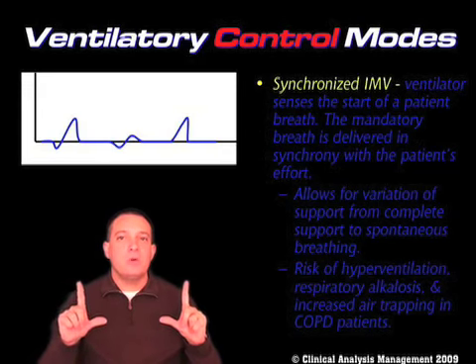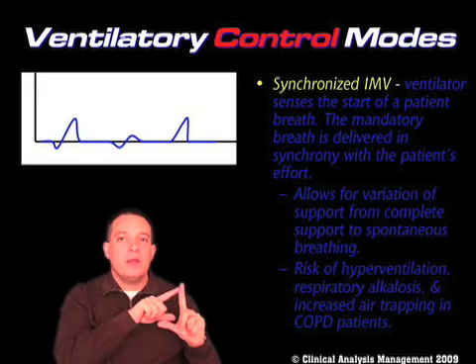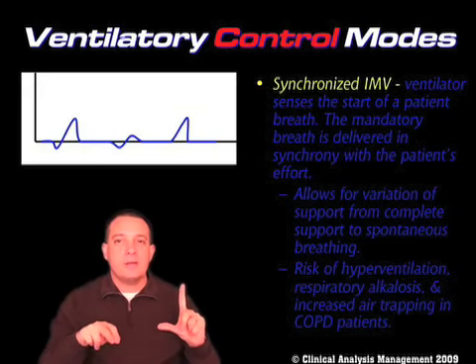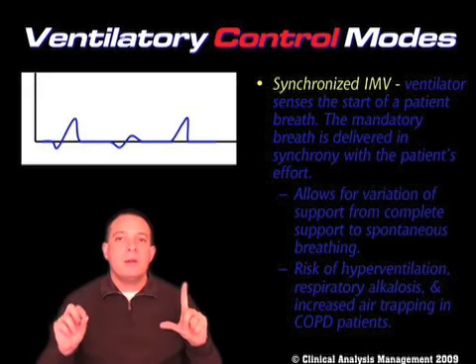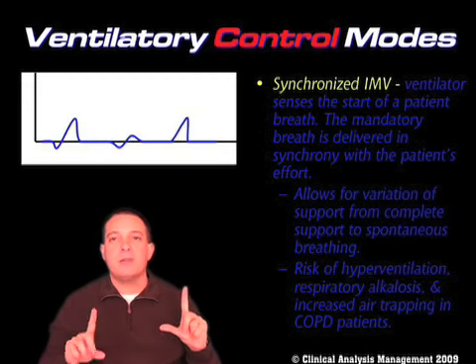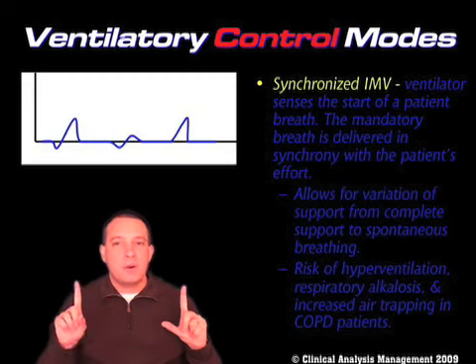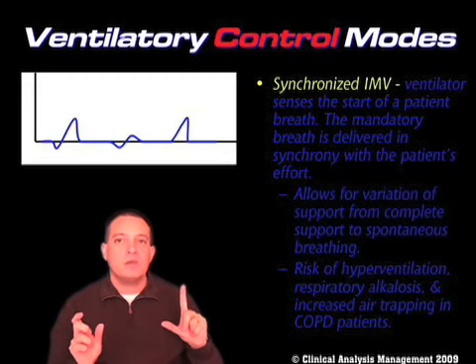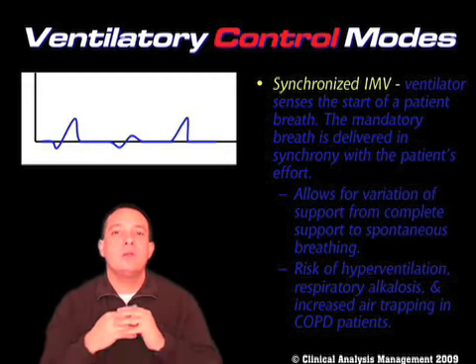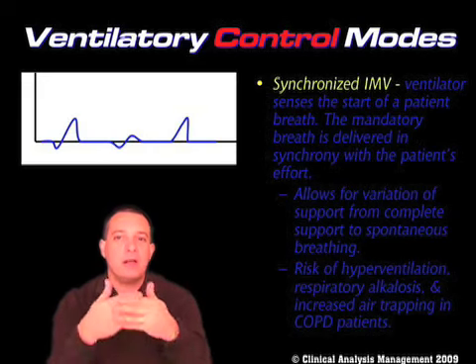Well, if the window was, say, 1 second wide, then if the patient gets their ventilator breath at 1 second, nothing happens at 2, nothing happens at 3, nothing happens at 4, nothing happens at 5. But at second number 6, the patient says, I want a breath, and they start to take a breath. Instead of the ventilator giving a breath on the next second, the ventilator, because the breath was taken in that window, says, oh, he's taking a breath now, so I'll just give him my breath now. And so the patient actually gets a full-on ventilator breath.